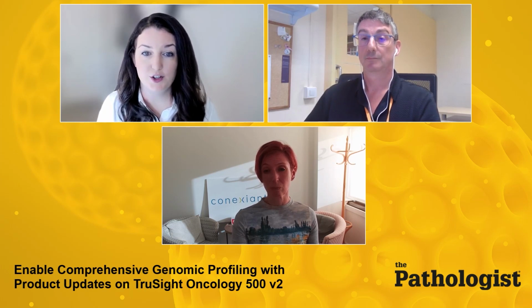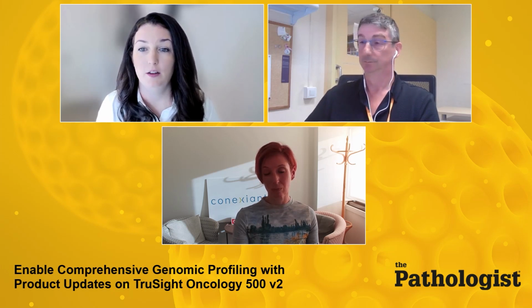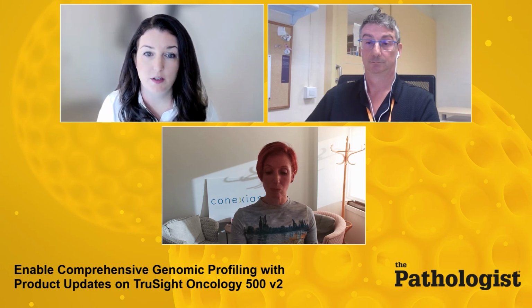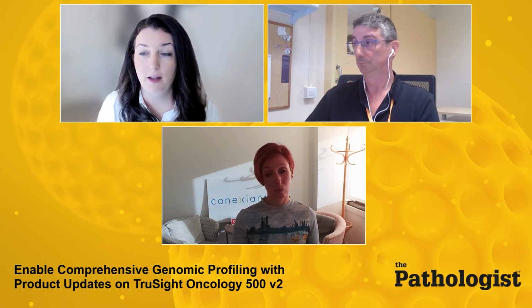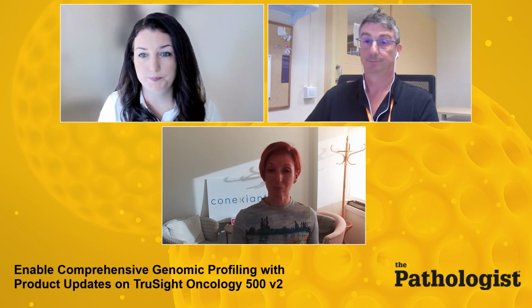Yes, so the limit of detection metric has changed from V1. Now for limit of detection, we are looking at that in terms of supporting reads, which is the output from the analysis software. With the V2 chemistry, due to all of the changes and improvements in library conversion and reducing down to one hybridization, we're now seeing higher levels of supporting reads with the V2 assay compared to V1, even at various input levels. So we do see higher supporting reads with V2, and that is a newer LOD metric compared to V1.